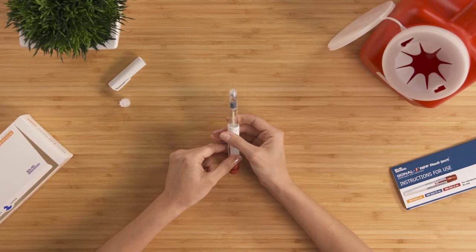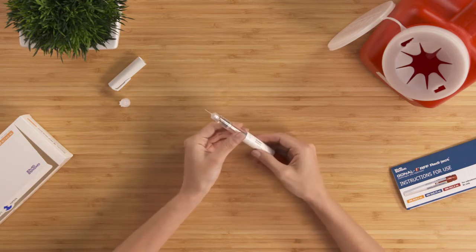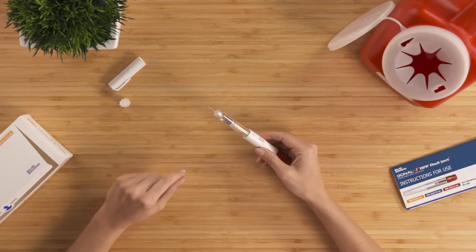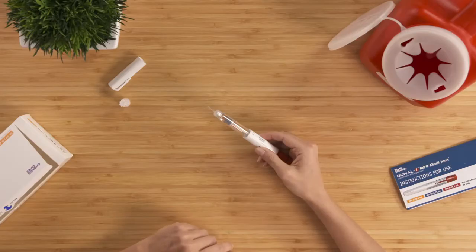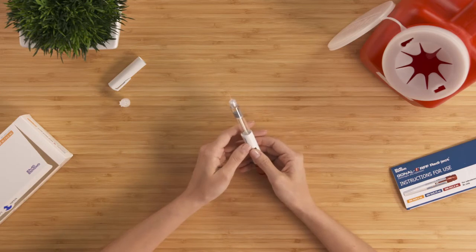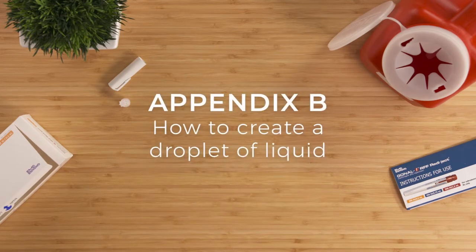Before I move on to the next step, I need to ask if you're using a new pen or reusing a pen. If your pen is new, as mine is here, then check for a droplet of liquid at the tip of the needle. If you see a droplet, then move on to step four. If you don't see a droplet or you're not sure, pause the video and follow the instructions for use in Appendix B, How to Create a Droplet of Liquid.